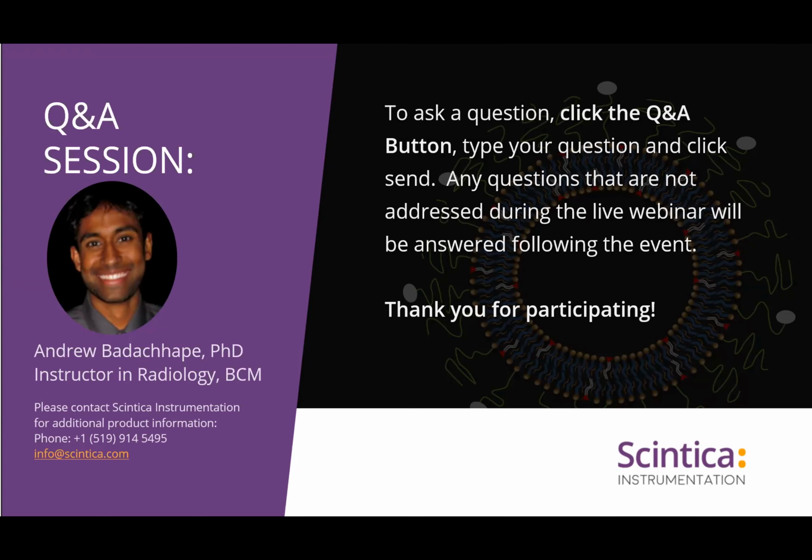But I would probably consider about a 30-minute protocol for your average anatomical scans, your different contrast-enhanced subsets of scans, and potentially other types of scans like FLAIR imaging or DWI, which could be very useful in conjunction with contrast-enhanced imaging that I haven't really talked about. Most of the sequences that I've been talking about in this presentation are relatively vanilla, but are still very robust. And I should note that you can perform T2-weighted and inversion recovery sequences using the Aspect scanners, and they are still valid at 1 Tesla.